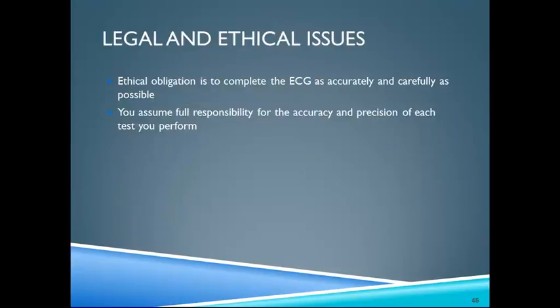Legal and ethical issues. It's an ethical obligation to complete the EKG as accurately and carefully as possible within a timely manner. We don't want you taking 20 minutes to do an EKG. It should take you no longer than 10 minutes. I know at the Marshfield Clinic here in Wausau and in Marshfield, they are doing EKGs every 10 minutes. To assume full responsibility for accuracy and precision for each test that you perform.